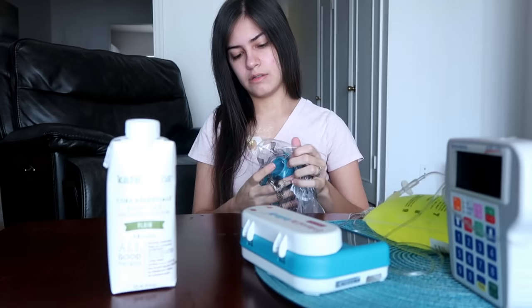And what I always found interesting is with my infusions and port stuff, I have to follow sterile protocol very meticulously, but with feeds, when you eat, it's not sterile. So we keep it clean, but not sterile. It was something I had to get used to because I was so used to my port and the sterile protocol.